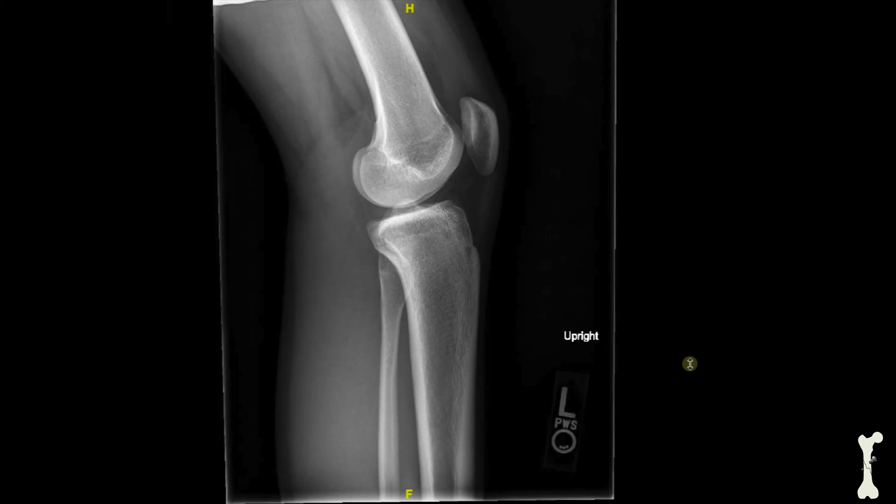In this next view, we have what's referred to as a lateral knee x-ray — looking at the knee from the side, not from the front. Again, we can see it's the patient's left knee, and the patient is standing because of the three beads indicating upright positioning. We can see some of the soft tissue, skin, and underlying muscle. Here is the femur, and you can see how the femur curves back and around towards the front of the knee. These areas are the femoral condyles that we first pointed out in the AP view. Here's the patella, or kneecap, and here's the shin bone, or tibia, going up towards the joint.